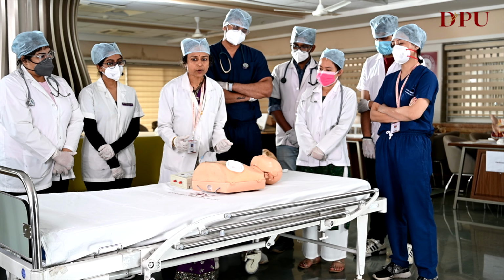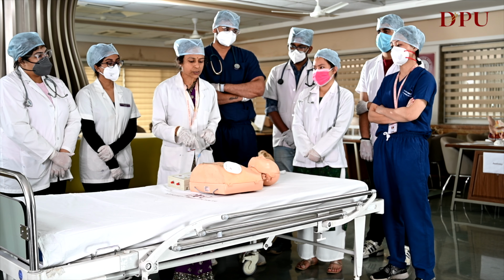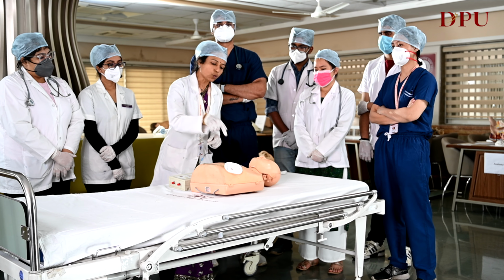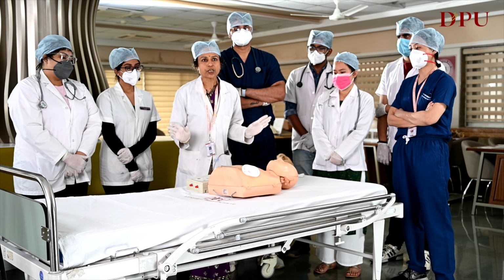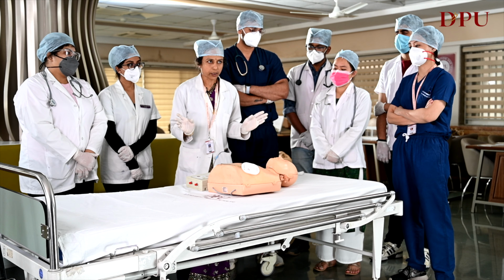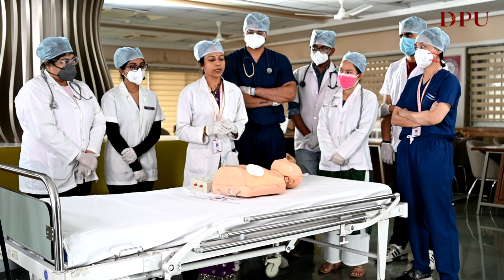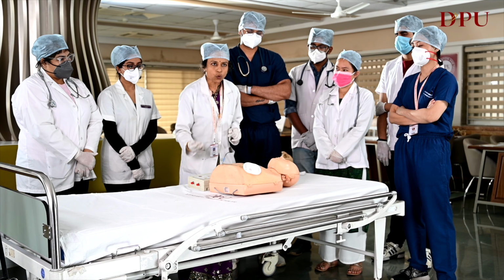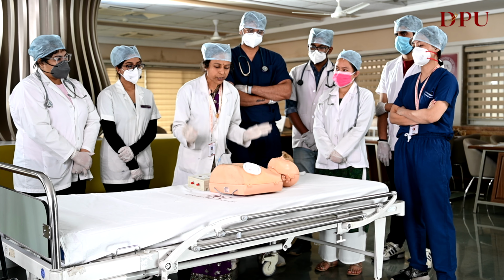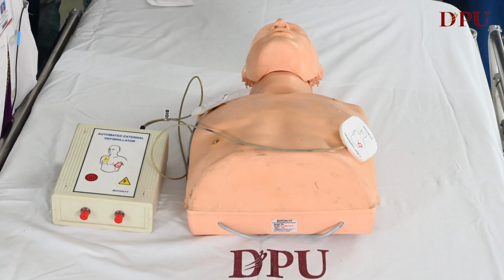Once the shock is delivered, there will be a tetanic contraction or contractile movement of the victim's body, and then you have to immediately resume chest compressions. So these are the steps of the automated external defibrillator. After that, chest compressions continue, 30 compressions, 2 breaths, and every 2 minutes you have to check with the AED whether the rhythm is shockable or not.